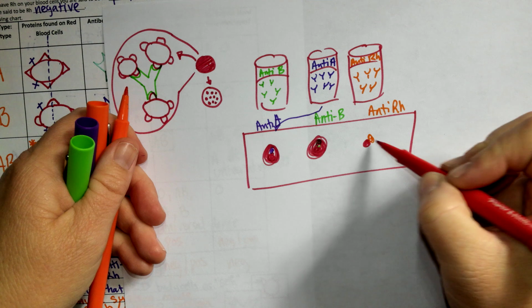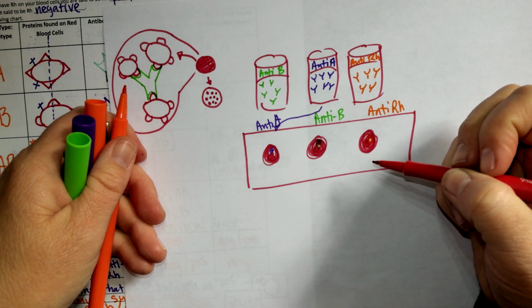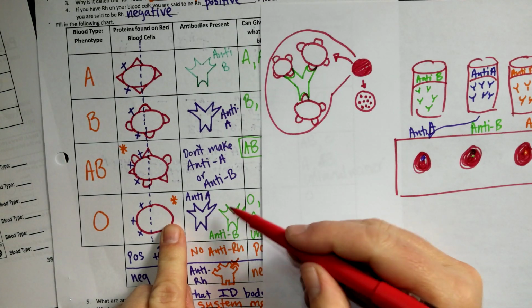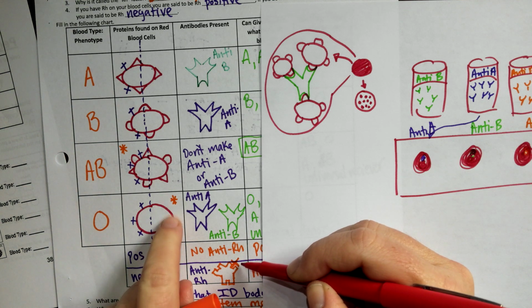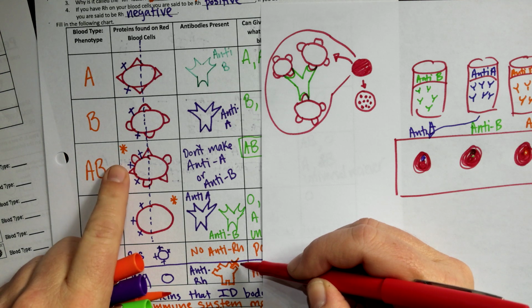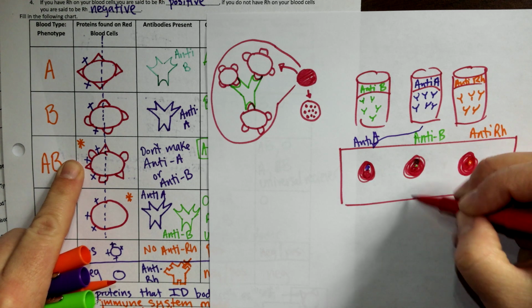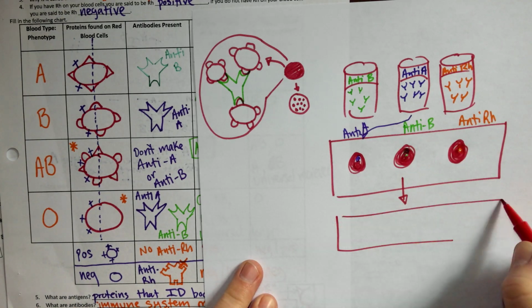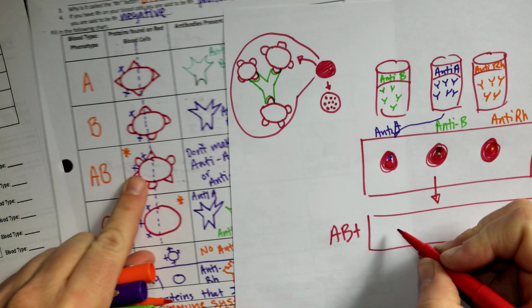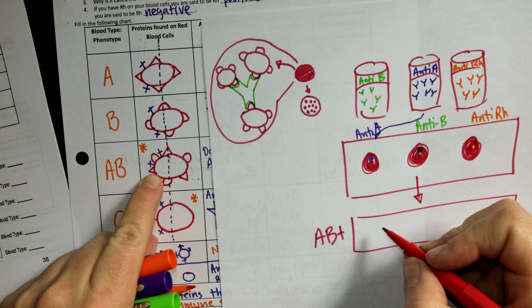After some time, these antibodies are going to have a chance to either grab on or not grab on. If, for example, the blood looks like this, none of these 3 antibodies can grab this because there's no shapes that can be grabbed. Whereas this one, if you were type AB positive, then what you would start to see is, let's pretend this is like time going by. If you're type AB positive, your blood has the special little bumps, RH factor, and triangles.